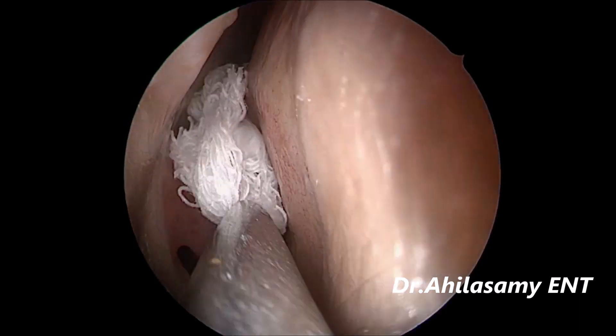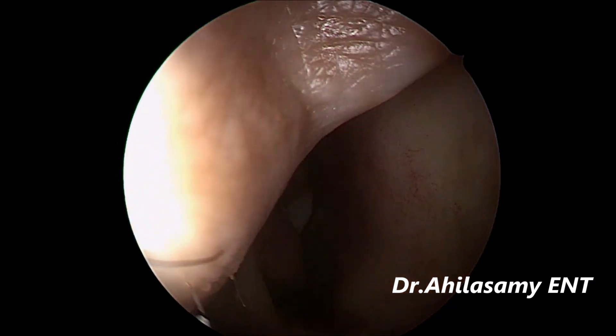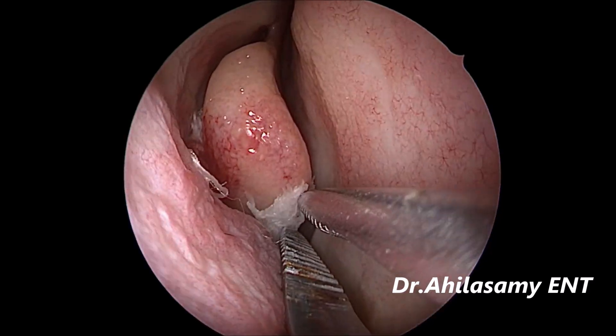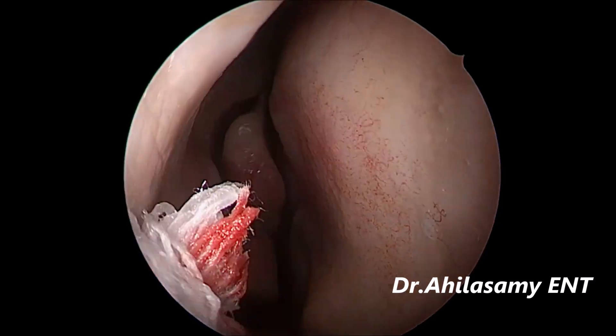Never injure the turbinates of the septum while packing. My young doctor has slightly injured the middle turbinate, which should not have been done. This video is specially shown for youngsters — not to injure the turbinates.